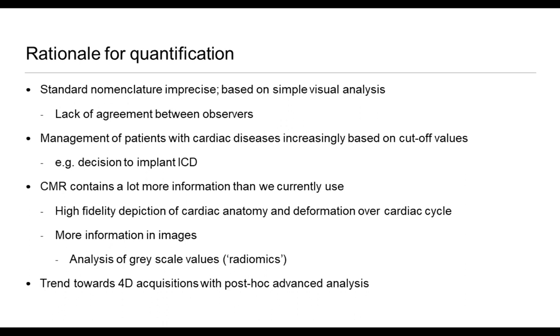And the final reason is that there's a trend also in MR to 4D acquisitions, where in retrospect, we choose the plane that we want to analyze or the specific cut of the tissue that we want to visualize. So these are some reasons where precise quantification and visualization are very useful. And in the remainder of the presentation, I want to illustrate these points with specific examples.